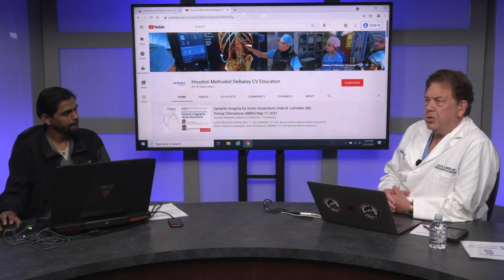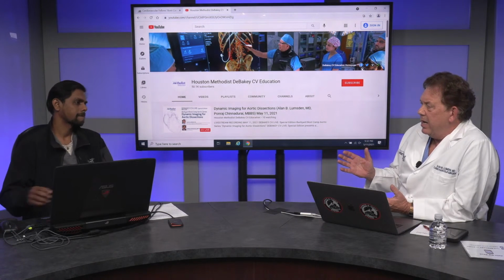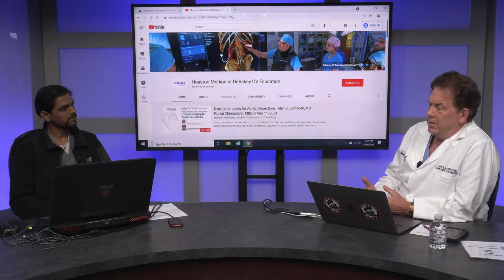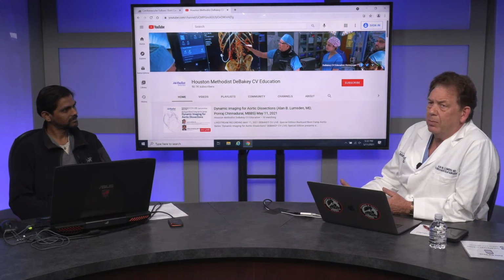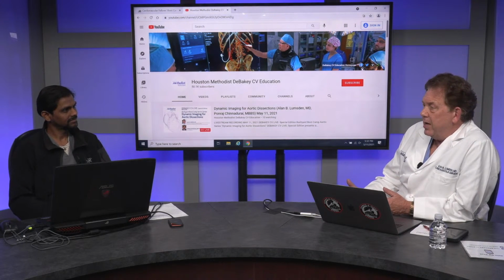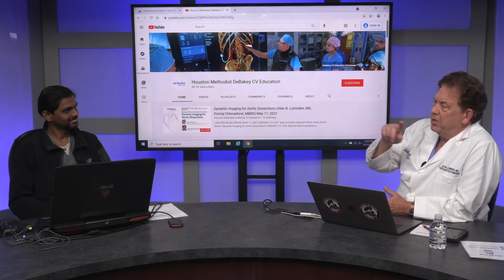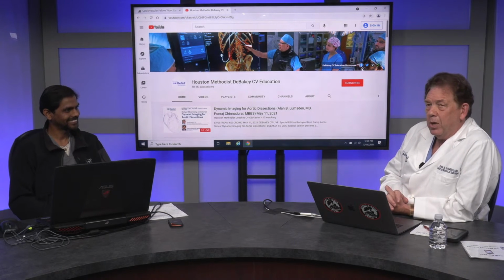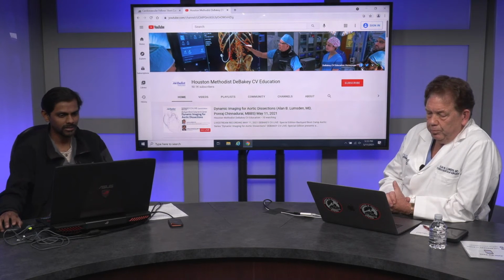And again, you touched on something. If we're just going to diagnose an aneurysm, we're not really advocating doing dynamic CT. It's where there's a dynamic process that's important. Dissection is certainly one of them, and the other thing that we've been using it for is troubleshooting endoleaks, knowing where the endoleak is coming from, because it's just like doing an angiogram. If it's a type 2 endoleak, you track which are the inflow vessels and which are the outflow vessels. Obviously you'd like to get both of them, but if you're going to only get one of them, you sure want to optimize the target being on the inflow vessels. Okay, so let's get going here.